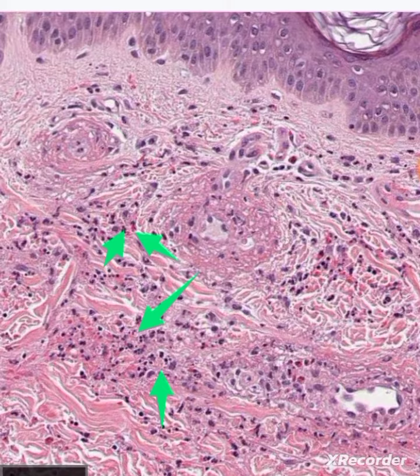So the fibrinoid necrosis or fibrinoid degeneration of the blood vessel wall, leukocytoclasia, and karyorrhexis or nuclear dust — these are all the characteristics of leukocytoclastic vasculitis. Thank you.